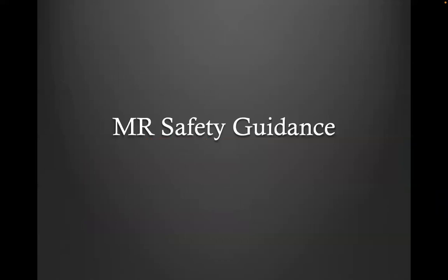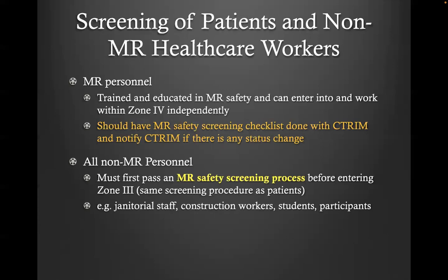Okay, so we've gone through all the MRI components and their hazards. Now let's go to our MRI safety guidelines and mostly what we do at CTRIM. Screening is very important for all non-MRI healthcare workers. For all MRI personnel, if you've gone through the training, you are considered MRI personnel. You are trained and educated in MRI safety.